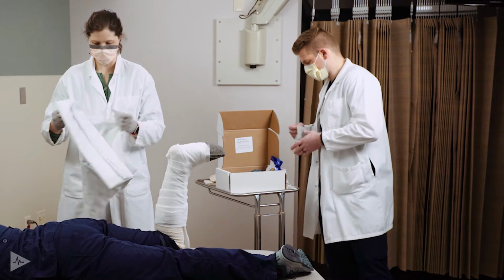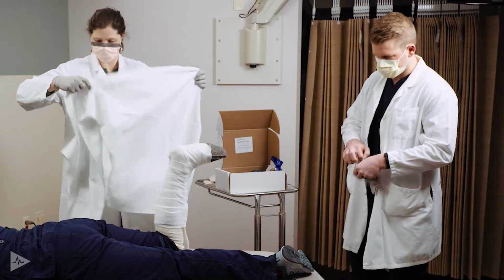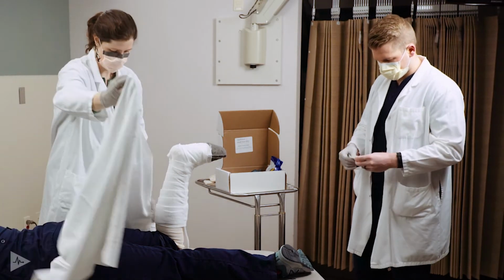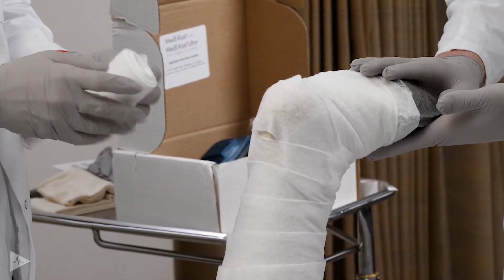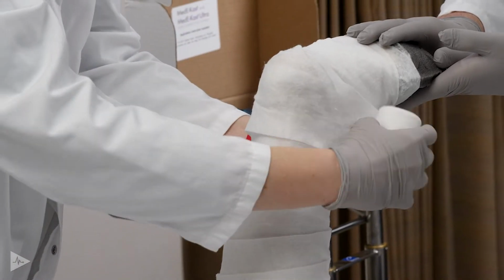I will often use a sheet to protect the patient's clothing from the plaster and fiberglass components of the casting system. So we'll just drape that over the patient's clothing. And so I see here there's a little bit of a gap on the ankle. So I do have some extra padding, and we will just be sure we cover that so it's adequately protected.